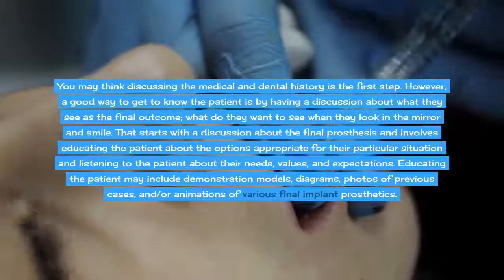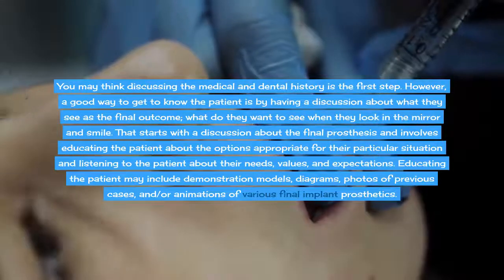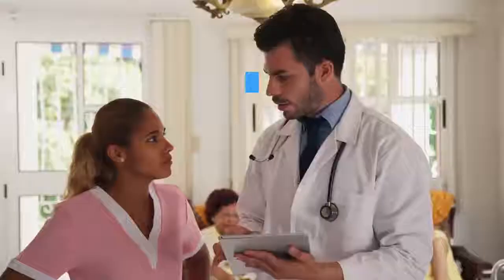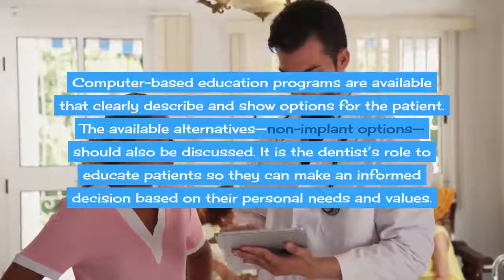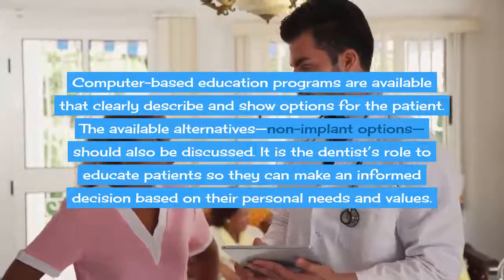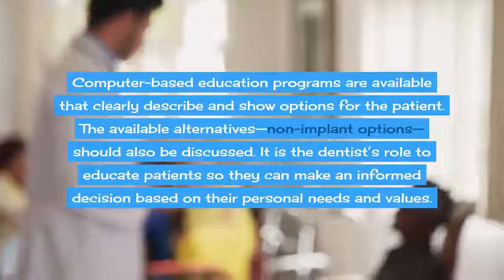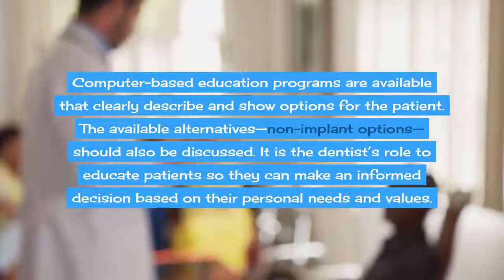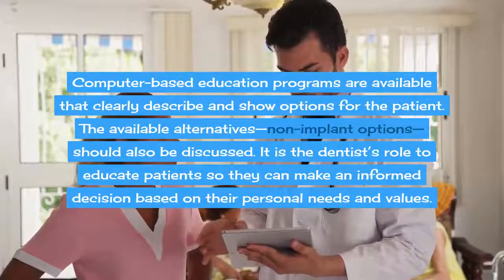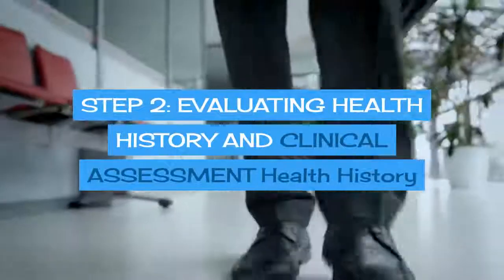Educating the patient may include demonstration models, diagrams, photos of previous cases, and/or animations of various final implant prosthetics. Computer-based education programs are available that clearly describe and show options for the patient. The available alternatives, non-implant options, should also be discussed. It is the dentist's role to educate patients so they can make an informed decision based on their personal needs and values.